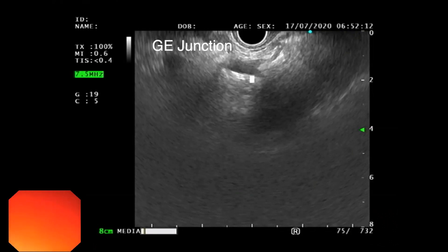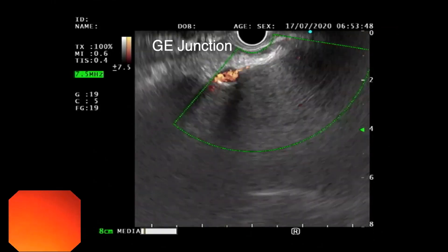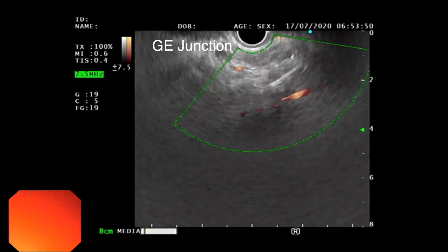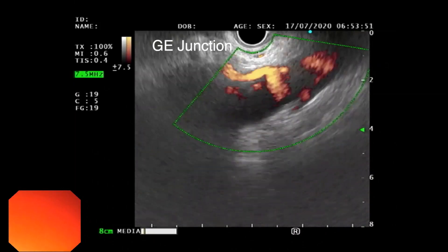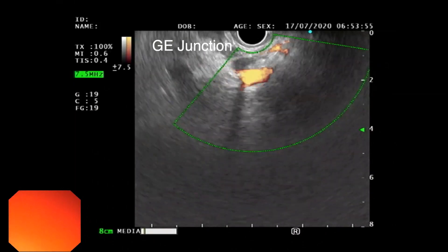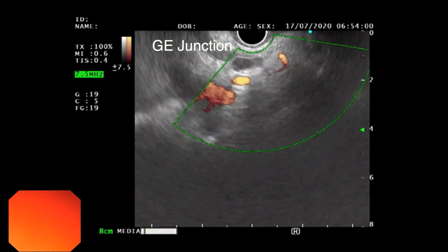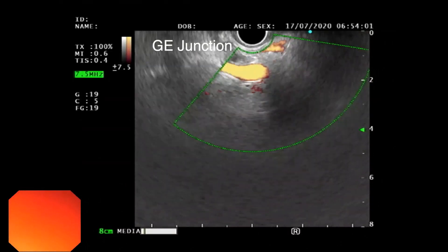The first branch arising from the celiac trunk is the left gastric artery. After evaluating the various branches of the celiac trunk, we can slide forward with the scope to highlight the body of the pancreas.